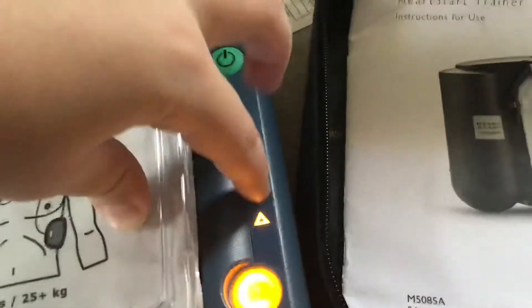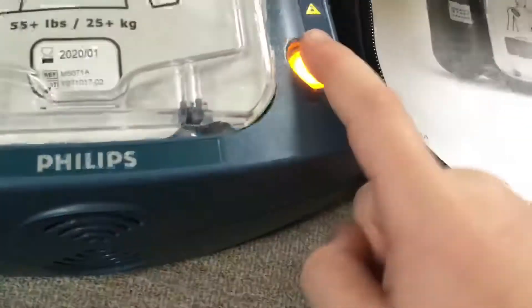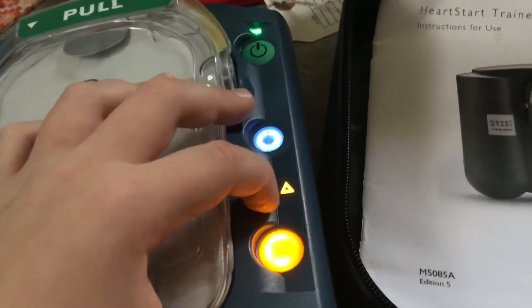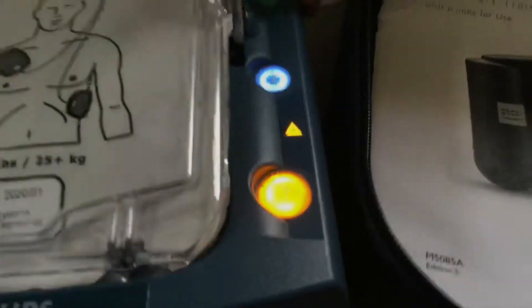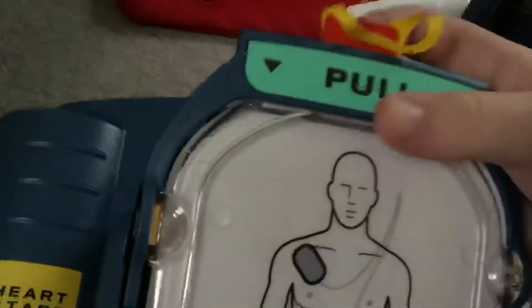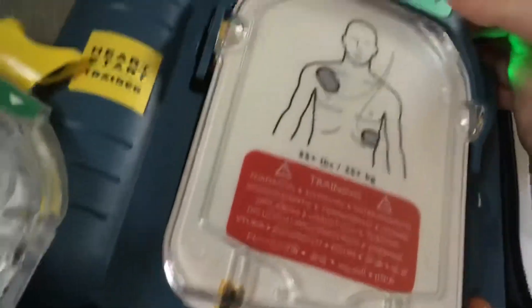It says 'cartridge type not recognized' — everything tells you 'pads not usable, insert new pads cartridge.' Now with the real pads: slide the bottom in like that, then push in the top. It says 'adult training pads — press the flashing blue button to choose training scenario.' That's correct recognition.